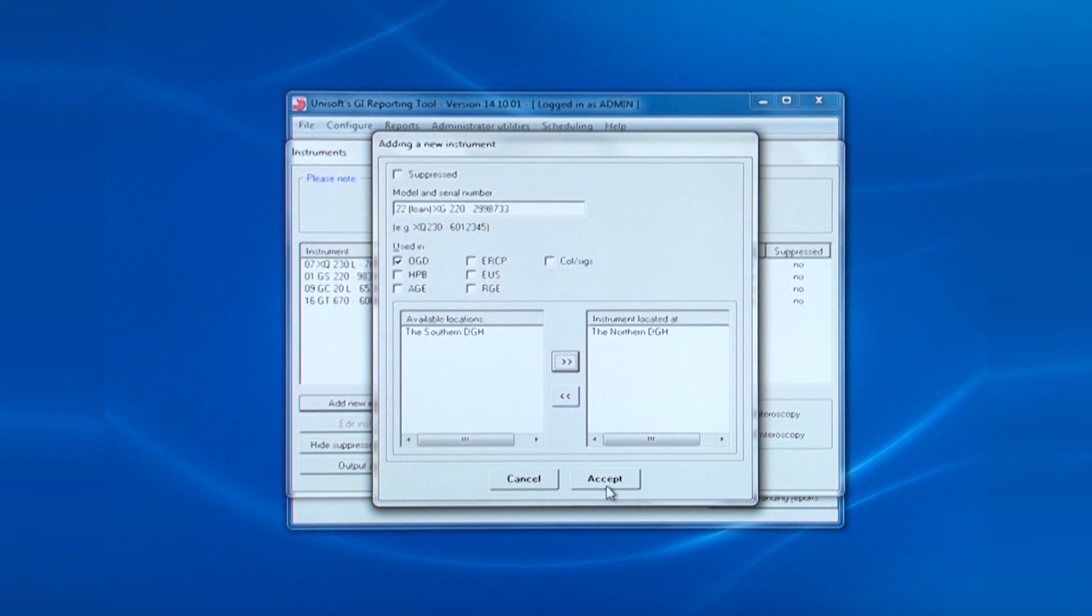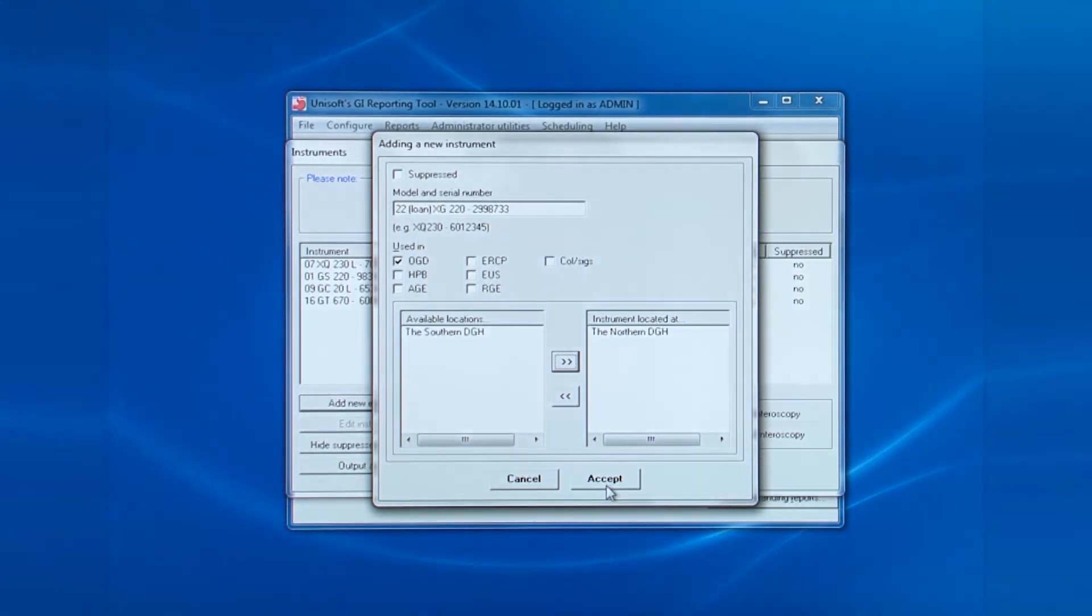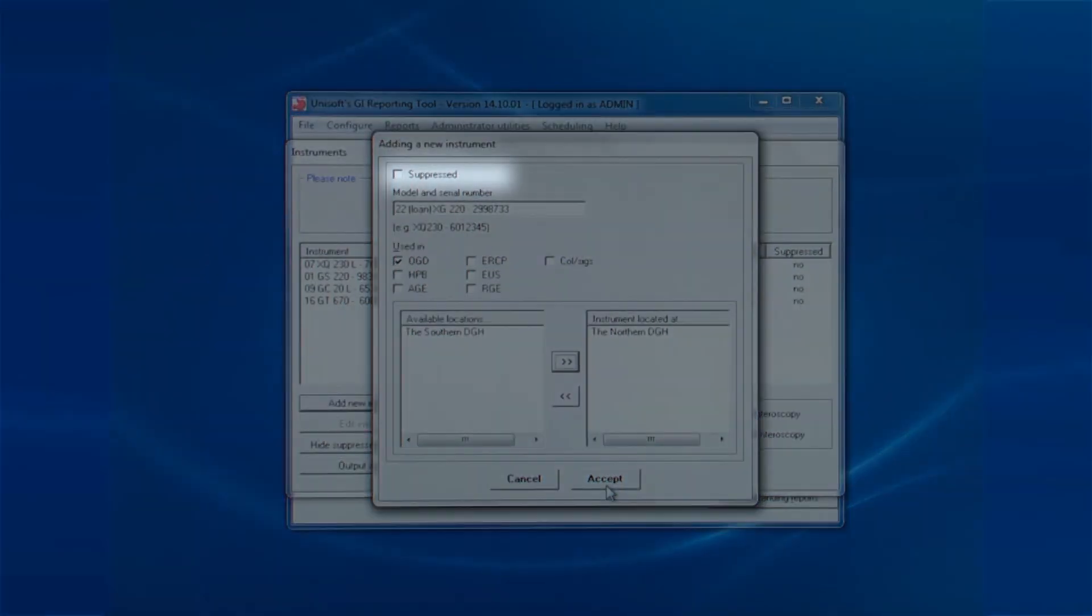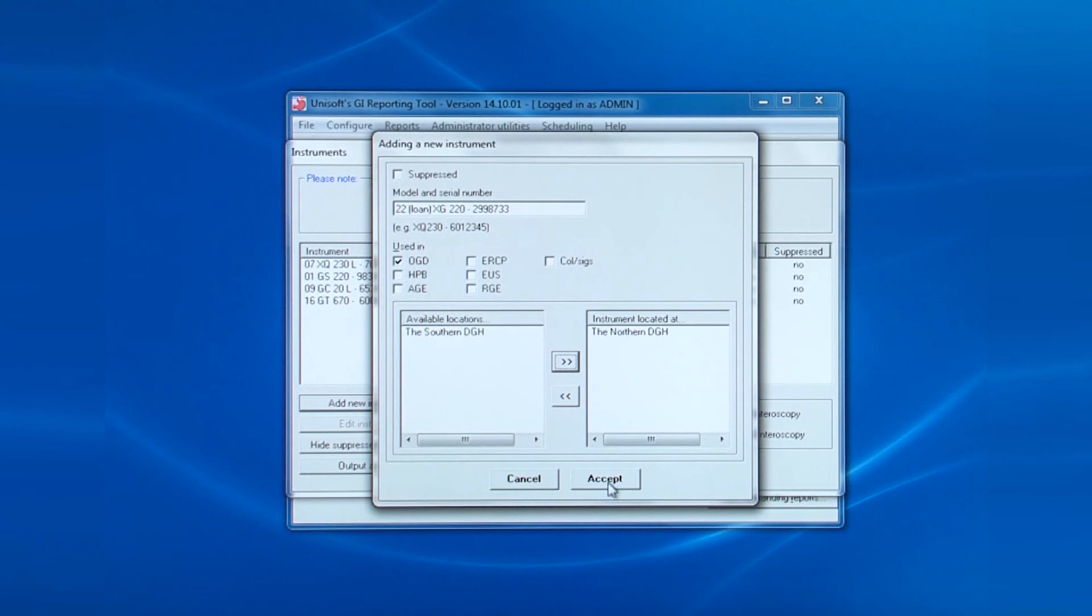If a scope is no longer used, then edit it and it can be suppressed from appearing in future drop-down lists.